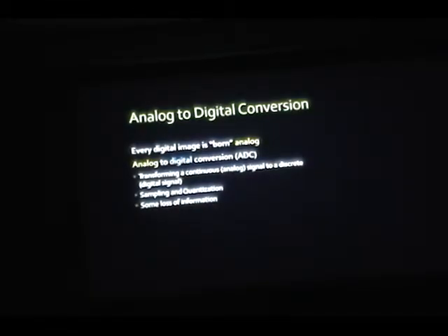So now, all the digital images that we are going to use, when I say digital images, the ones that we are using in our dental clinic, is one digital image. Films are analog ones. But even if it's a digital image, it starts as an analog image and it will be converted to digital. To do that, we use something called sampling and quantization.